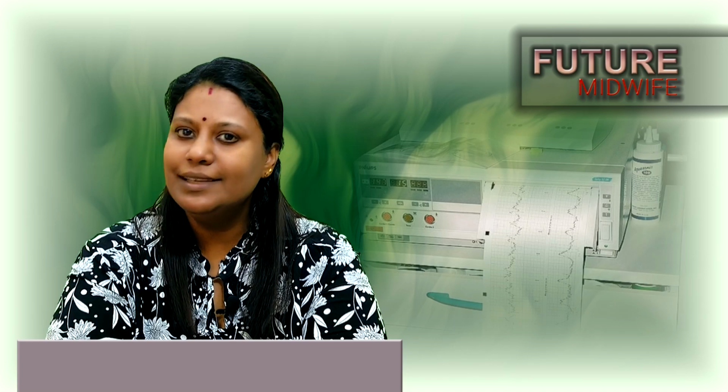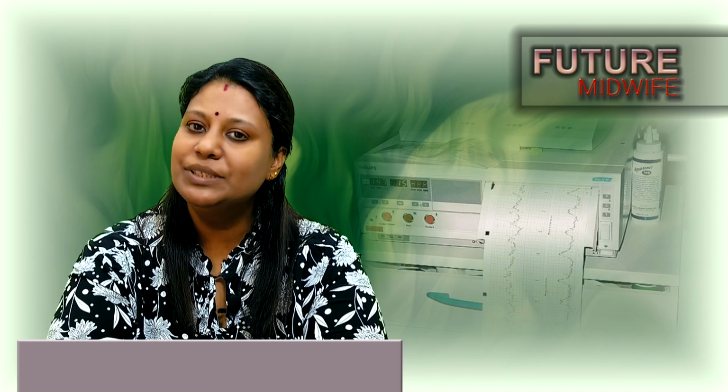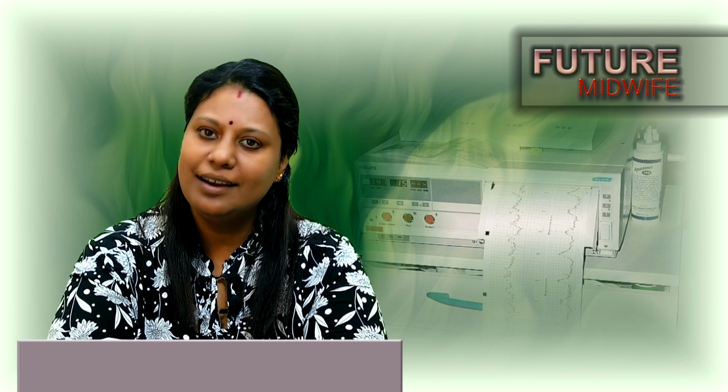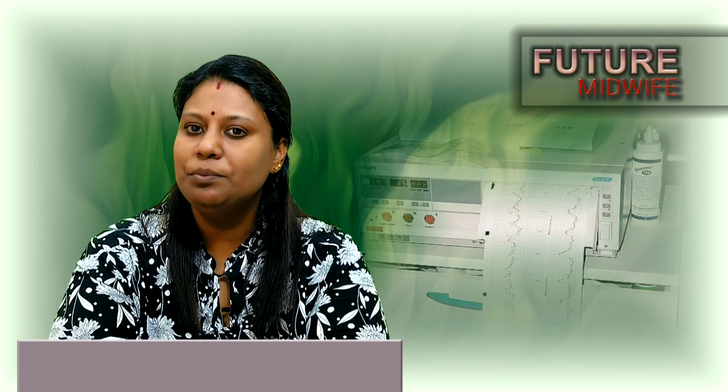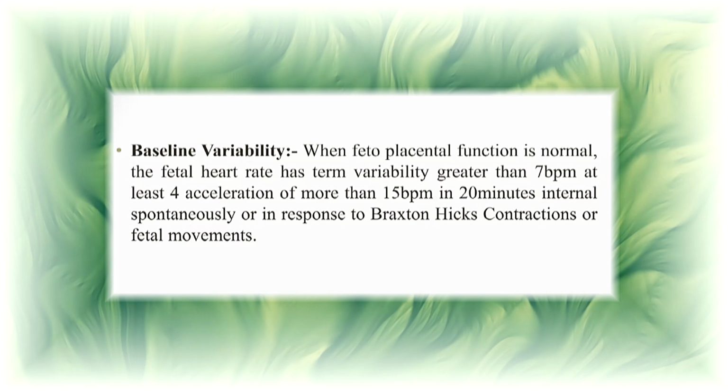Here we reach the basic interpretation of CTG. First we'll see the baseline fetal heart rate, that means the heart rate between the uterine contractions. A heart rate of more than 160 beats per minute is called fetal tachycardia. A fetal heart rate below 120 beats per minute is called fetal bradycardia. Usually it is indicative of fetal hypoxia. A constant fetal heart rate between 110 to 120 beats per minute will be indicative of cord compression.